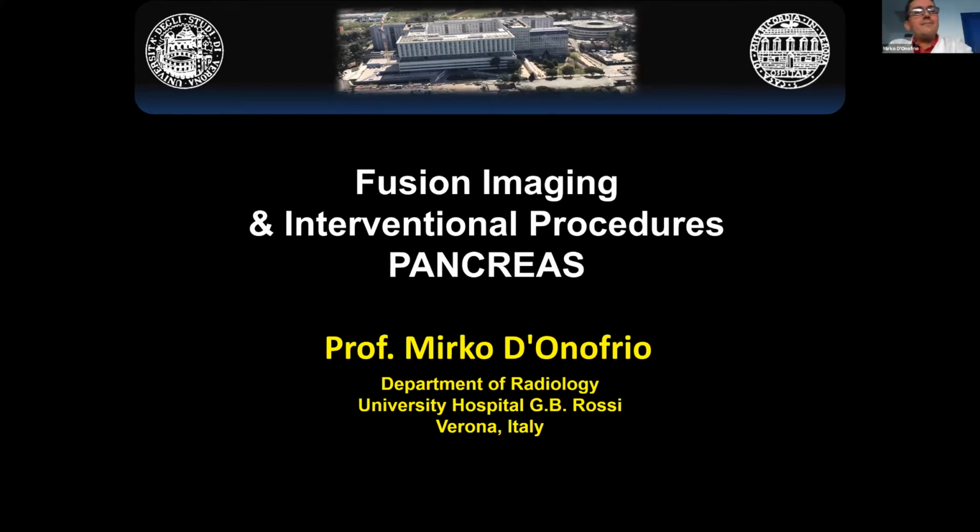So it is a little bit more complex, all these imaging methods together, but this is to reach a higher level of our investigations. But it's important, in my opinion, to understand where we want to add all these techniques together. So it's important to understand which problem we want to solve by using fusion.